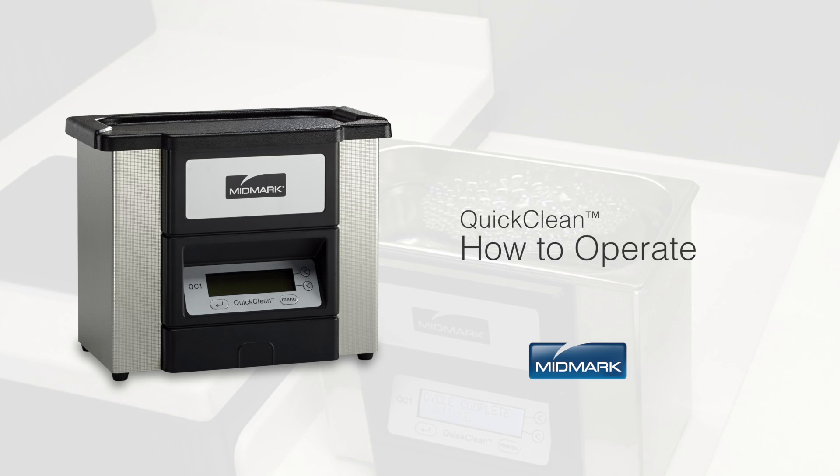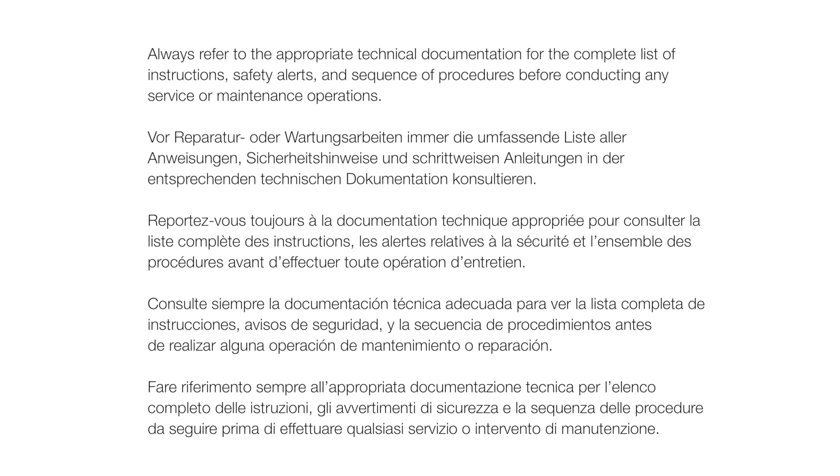This video provides an overview of how to operate your Quick Clean ultrasonic cleaner. Always refer to the appropriate technical documentation for the complete list of instructions, safety alerts, and sequence of procedures before conducting any service or maintenance operations.